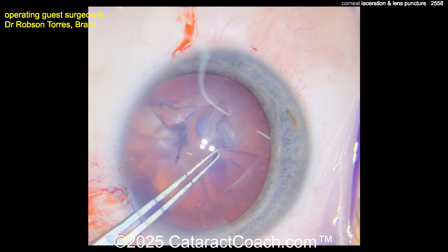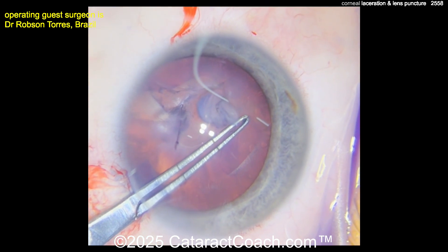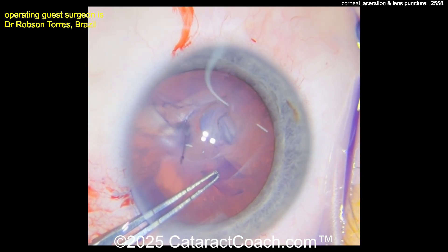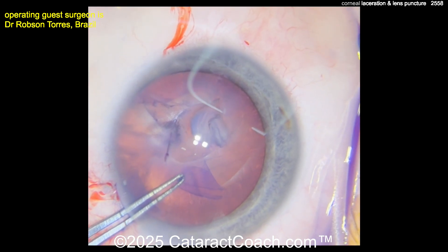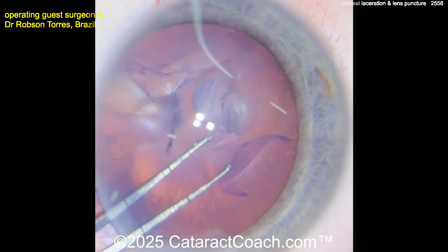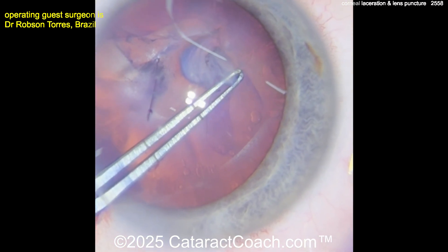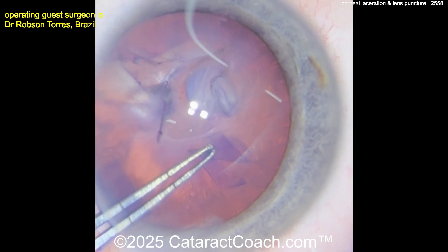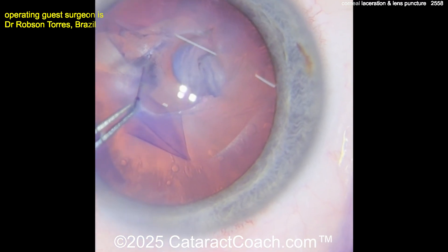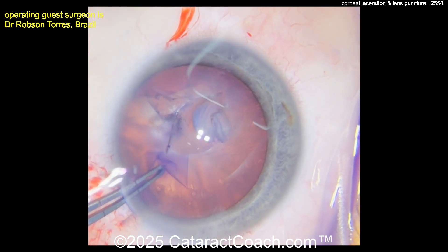Again, the trypan blue dye is going to help you a lot to visualize it. Don't let the rhexis get too large — bring that in a little bit. You can see it's a young patient and the lens itself probably got swollen as the lens capsule was punctured; aqueous will go in there and fluff up and swell those lens proteins. Taking time here to get a really nice-looking rhexis, but it does want to run out, so you want to grab onto it. Here's the little maneuver — pulling backwards to bring that in. Beautifully done, very nice.